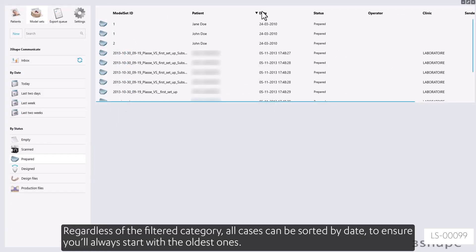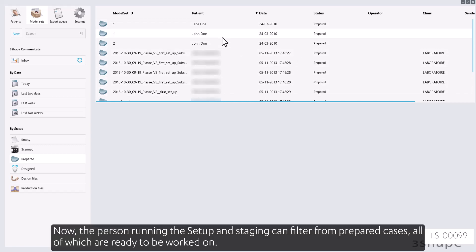Regardless of the filtered category, all cases can be sorted by date to ensure you'll always start with the oldest ones. Now, the person running the setup and staging can filter from prepared cases, all of which are ready to be worked on.